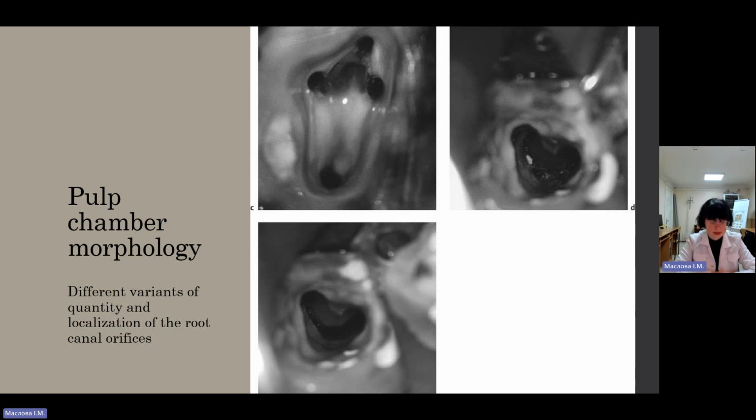Access to the root canal system is aided by examination of coronal anatomy, tooth position and angulation, and external root morphology. You can investigate with the help of routine X-ray examination. The preoperative radiograph is preferably more than one, taken at different angles. It is necessary for the correct investigation of the quantity and the shape of the roots.